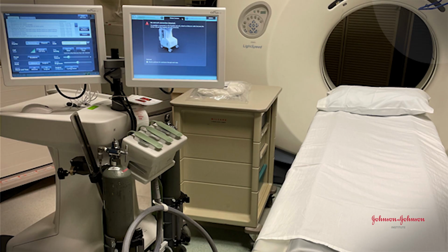Setting up the microwave machine, it's really easy. You just got to have the supplies there, and that everything is ready to go. And make sure you do this before you start any procedure. What we actually do is we scan patients on 5mm intervals, and this is just to minimize radiation.